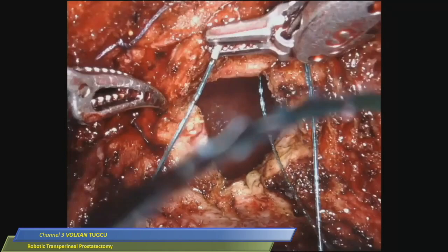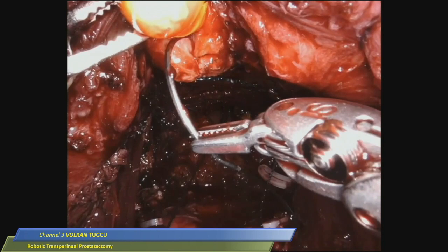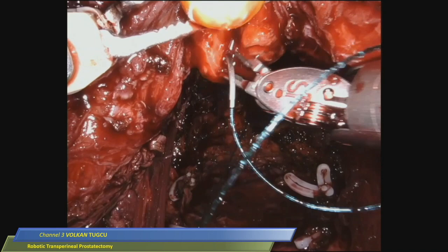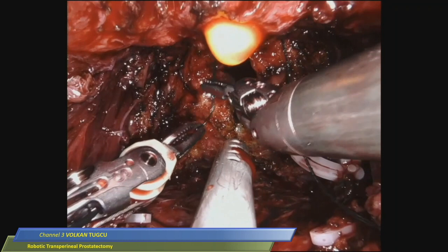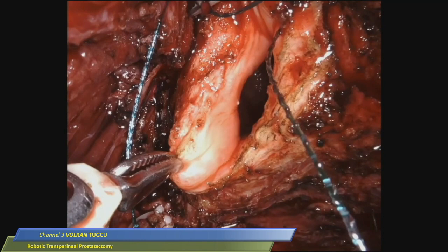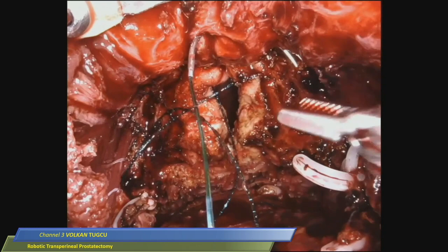Do you think this step is probably the most challenging, the most difficult in the beginning? Not difficult, only a narrow area. You can see the urethra mucosa, and the other suture is the same, urethra mucosa. Now there is a trick here. Traction of the bladder neck and urethra, the pressure is down. The difficulty is only that the anastomosis is narrow, but you can easily see this mucosa and bladder neck.